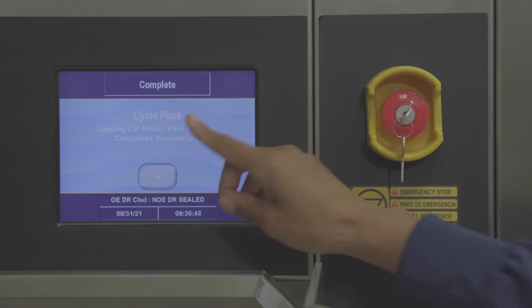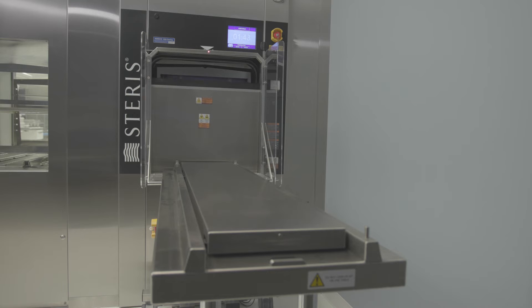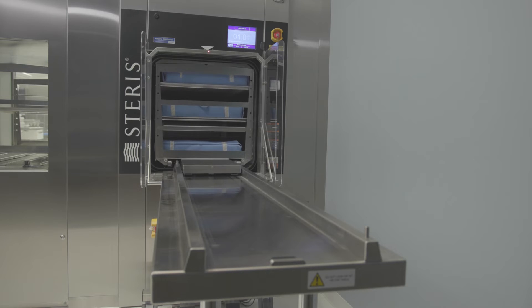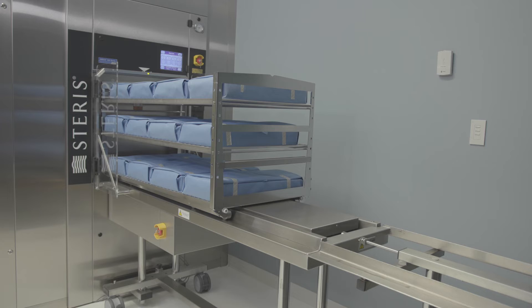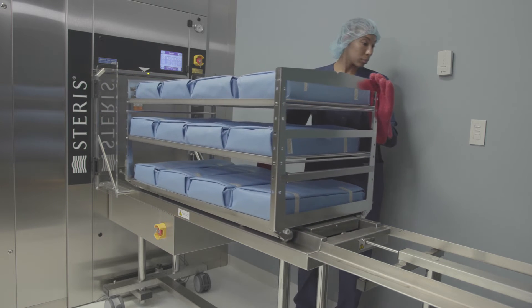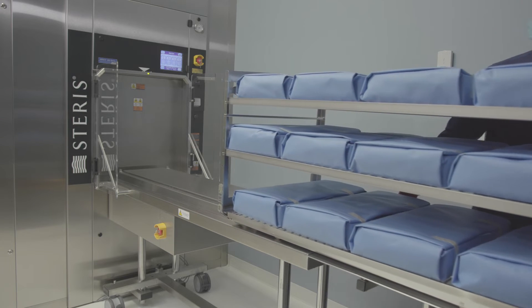When a cycle is complete, the sterilizer automatically detects if a sterilized load is on the unload table. If the unload table is empty, the unload side chamber door opens and the system automatically unloads the newly processed instruments from the sterilizer. Sterilized loads should be removed from the table to a cooling area away from air conditioning ducts. This allows the next loading car to be unloaded promptly upon cycle completion.